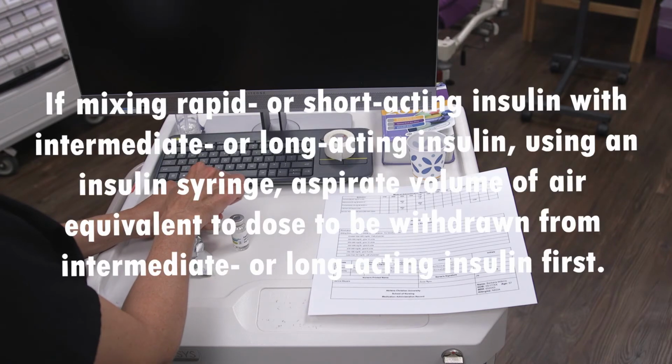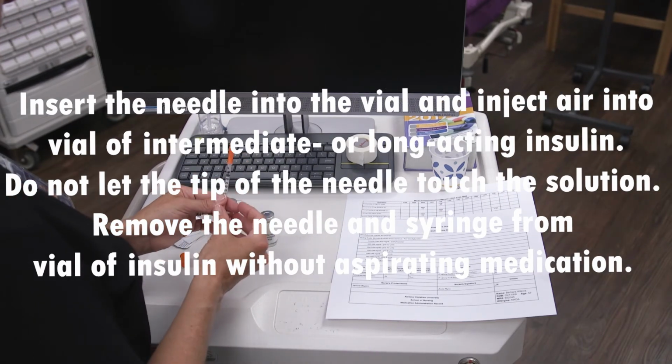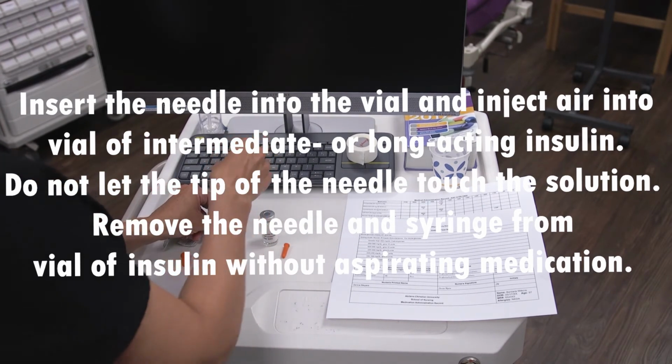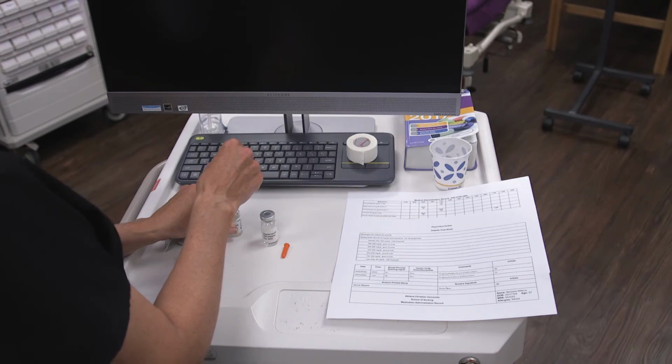If mixing rapid or short-acting insulin with intermediate or long-acting insulin, using an insulin syringe, aspirate volume of air equivalent to dose to be withdrawn from intermediate or long-acting insulin first. Insert the needle into the vial and inject air into vial of intermediate or long-acting insulin. Do not let the tip of the needle touch the solution. Remove the needle and syringe from the vial of insulin without aspirating medication.